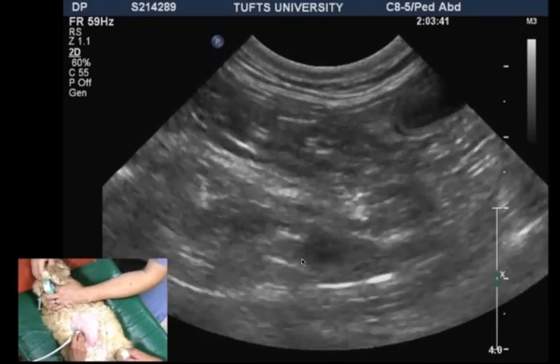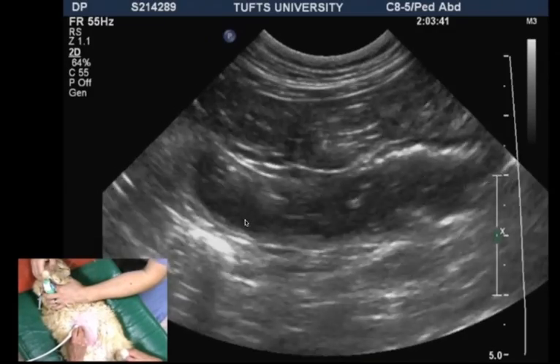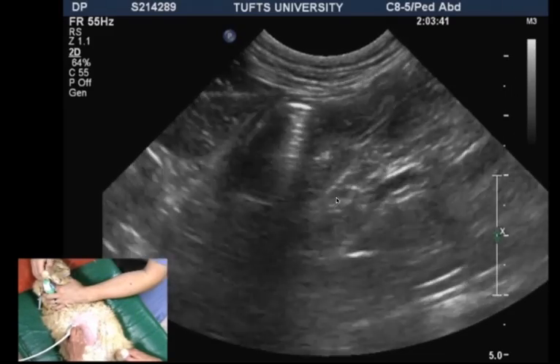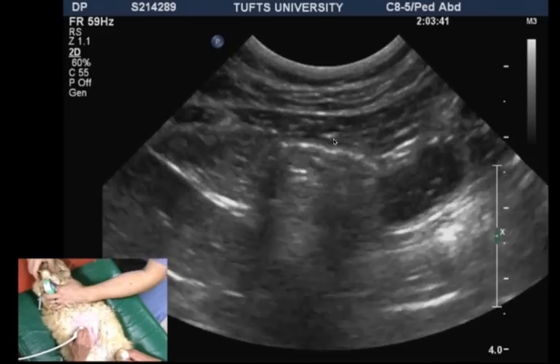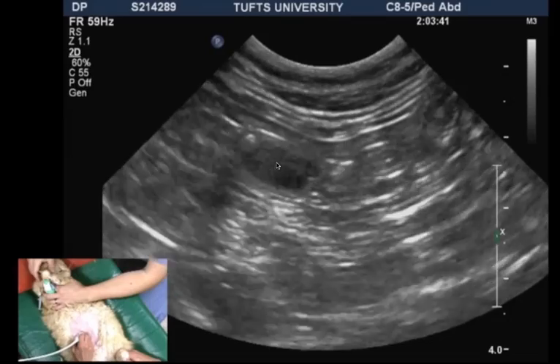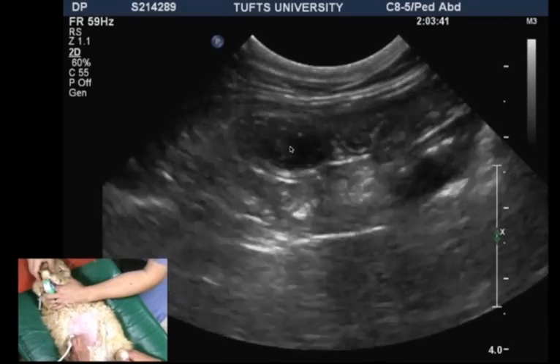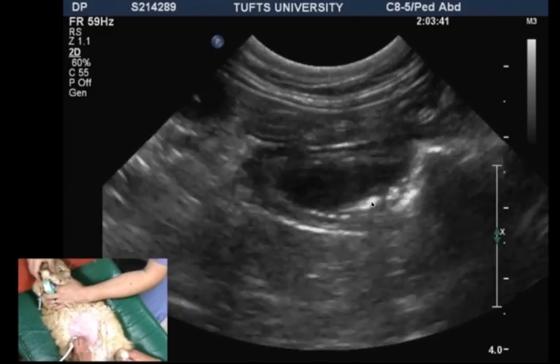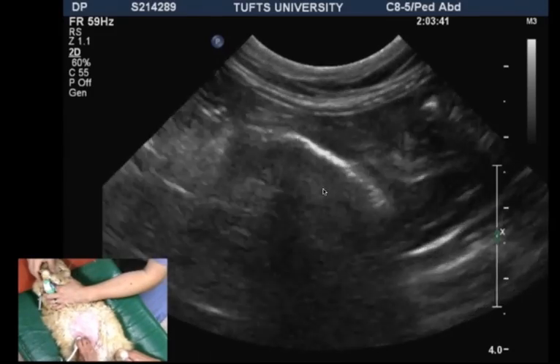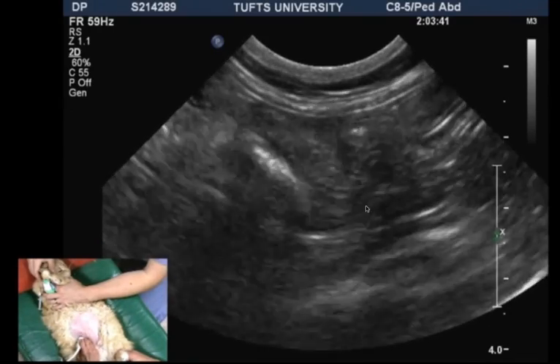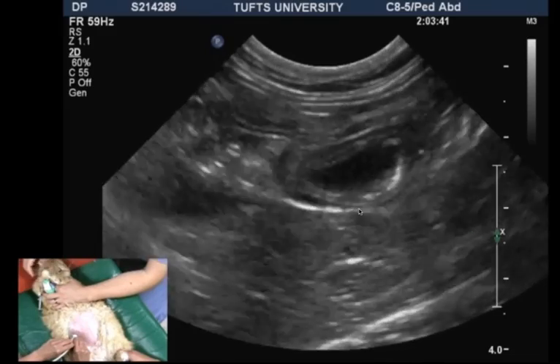It can be challenging to follow intestinal loops, but in this case, where we have moderate distension of the bowel segments, it wasn't too difficult to achieve that examination. We notice that the wall thickness and layering is still within normal limits in the distended segment. We end up following the last turn of this distended jejunal segment, leading to this angular structure that has a hyperechoic interface associated with strong shadowing, and the loop just caudal to that structure returned to a normal diameter. These ultrasonographic features are supportive of an obstructing foreign body.